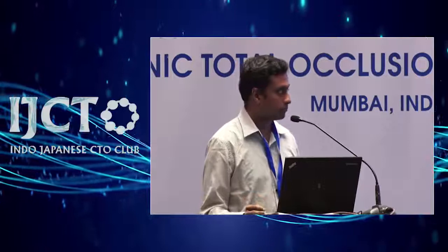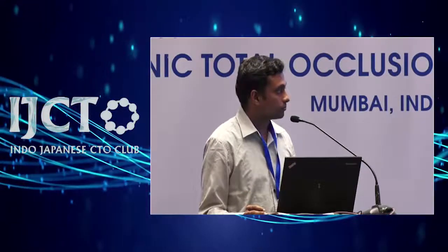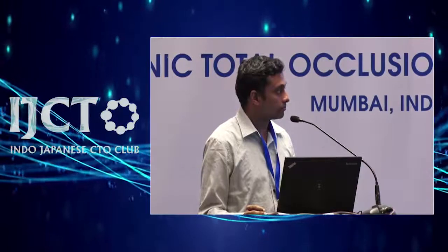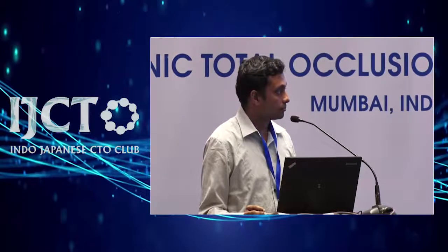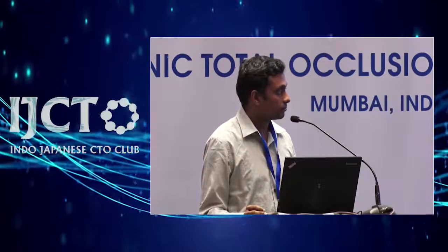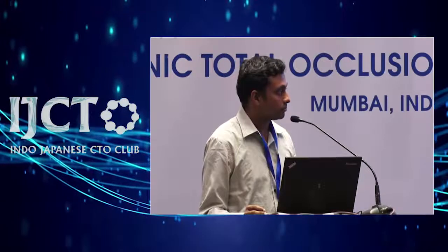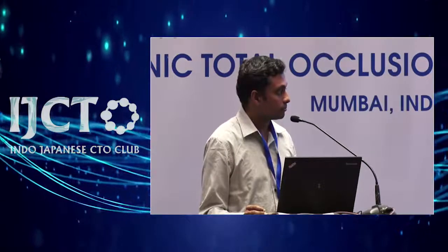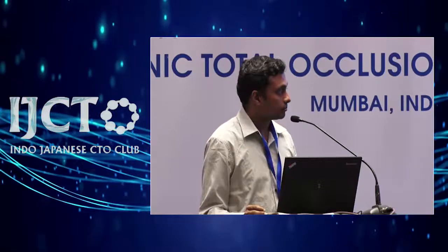Very well presented. You went through all the techniques, which was fantastic. You rightly said it's very easy if you are true to true. And what I found very easy is if you are subintimal in both antegrade and retrograde. I'll tell you why. It's sometimes challenging if your wire is antegrade, then you still have to get into the subintimal space or into the intimal space if either of them is outside.